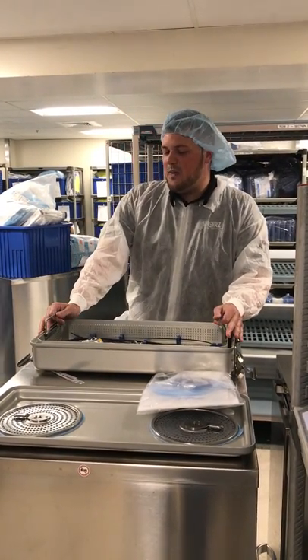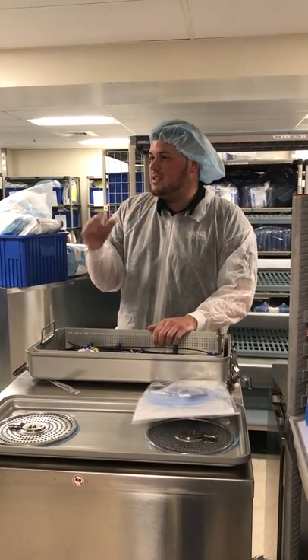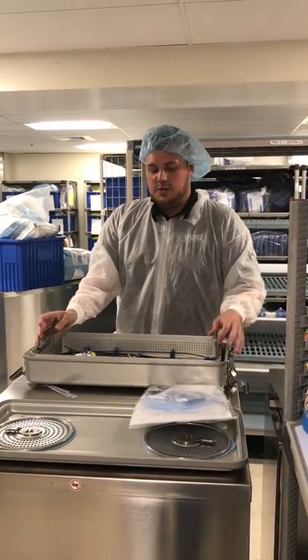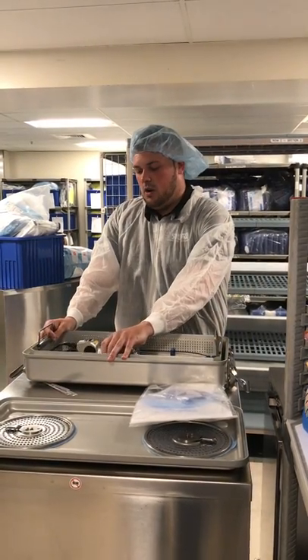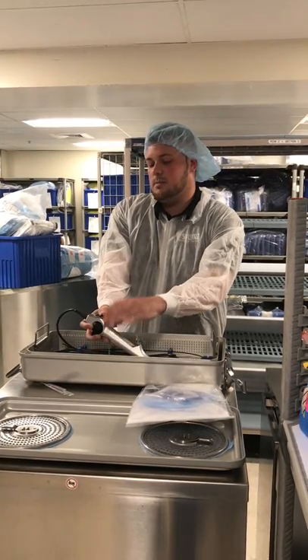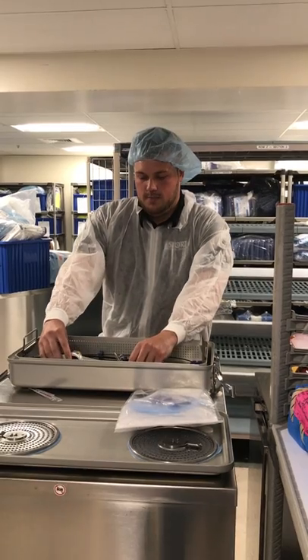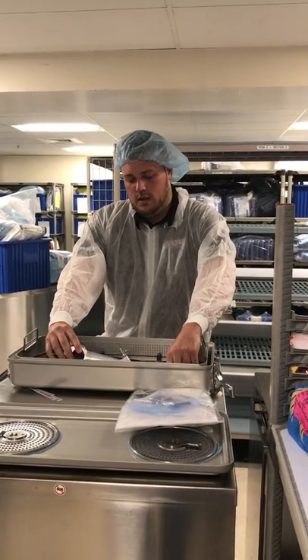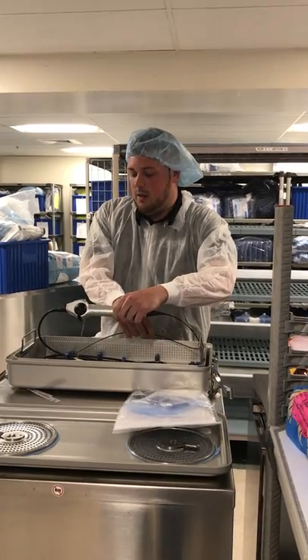You have about five flexible ureteroscopes — the ones that have the black body with the eyepiece that you look through. This one is replacing that. This is the video version, which means that all you need to do is plug in this chip right here. It powers on and has a built-in light source, so you don't have a lot of light posts.